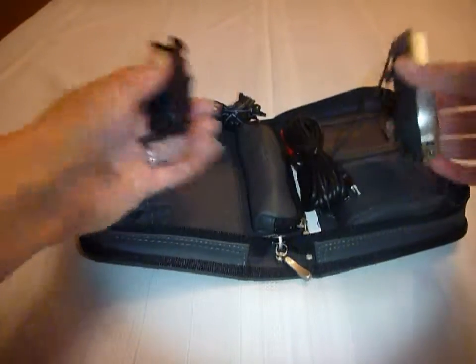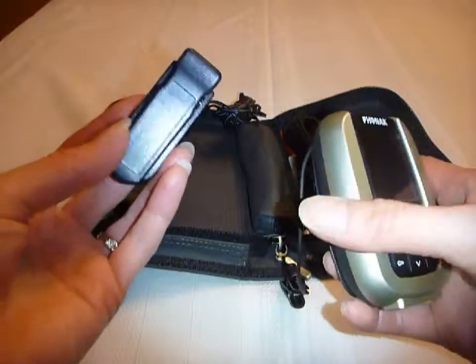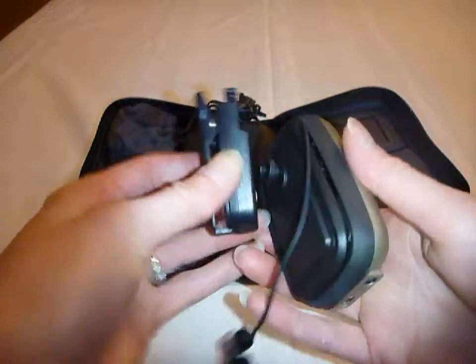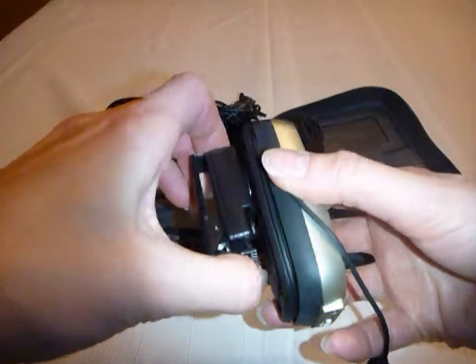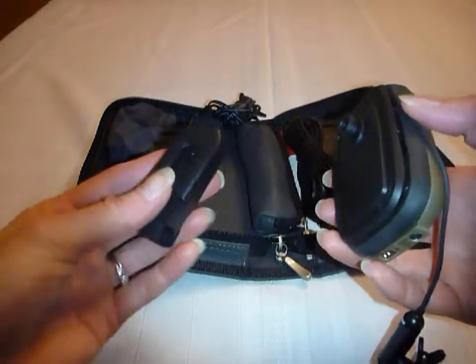There's also a clip so that you can hook the transmitter onto your belt. It just slides onto the black knob on the back, and you push the bottom button and it slides off.